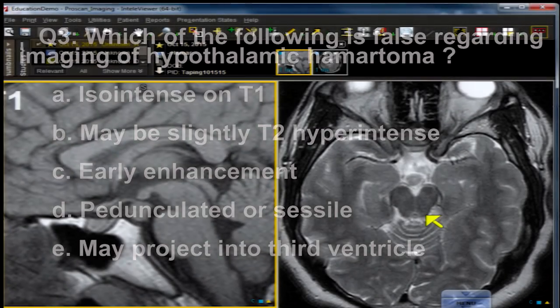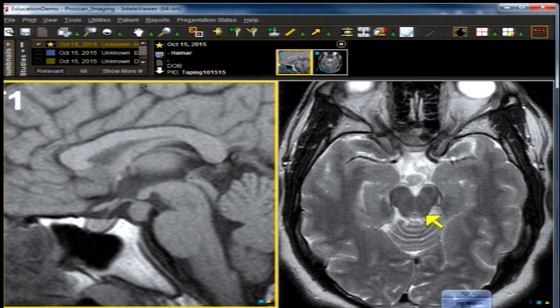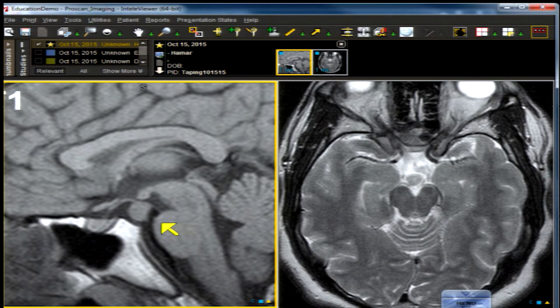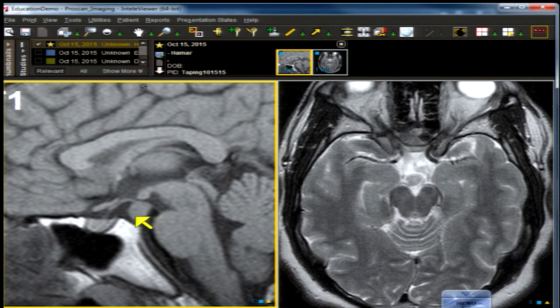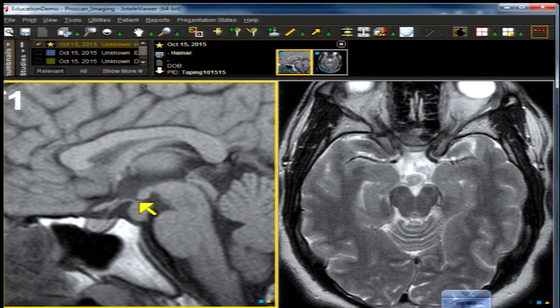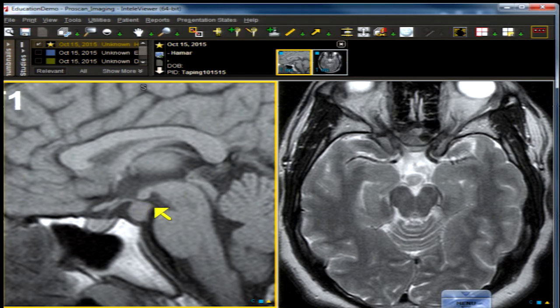Let's go back and look at our images. On the sagittal T1-weighted image, the mass has a very characteristic location — it looks like the tongue of the mammillary body is sticking down. These lesions can be located right under the mammillary body or just behind it, with a small web-like area of communication with the pituitary stalk.